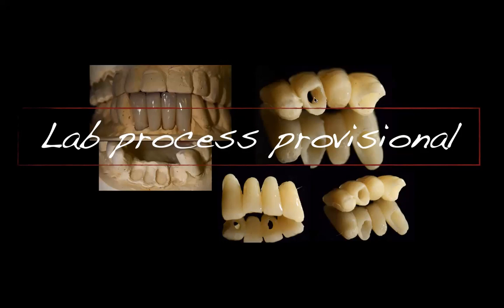Take a look at my temporary. You see it? I told my lab I'm placing an implant here, I'm placing an implant here. And you could see, why did I opt to have a cantilever? You see there's a cantilever here. There's an implant here, there's an implant here, and there's a cantilever.